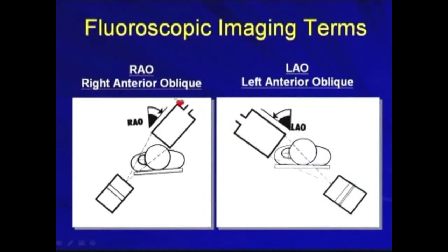We can also tilt the X-ray C-arm into the right anterior oblique or the left anterior oblique view. The right anterior oblique view is important, especially when we confirm the lead is pointing anteriorly to the RV apex or the right atrium appendage.